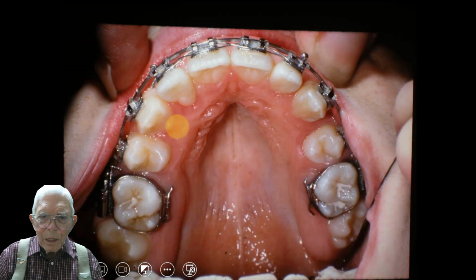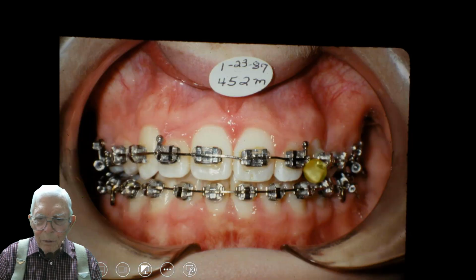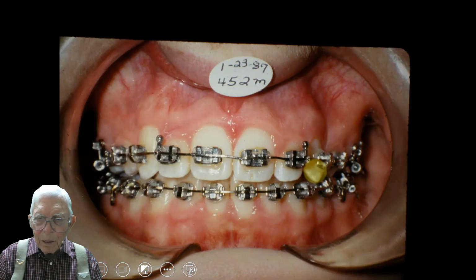This is 1986, and you can see the palatal roof up here. We've taken the second bicuspids out on the case, and here we took them out, and the space is there. Now this is 1987, and the space is closed up, and then we got the midline just pretty well lined up. There'll be that much difference in this tooth size.